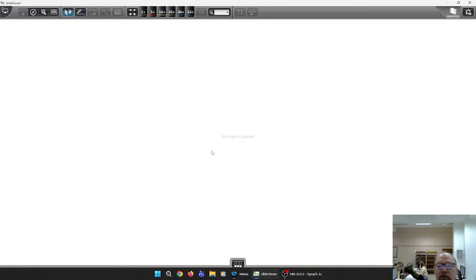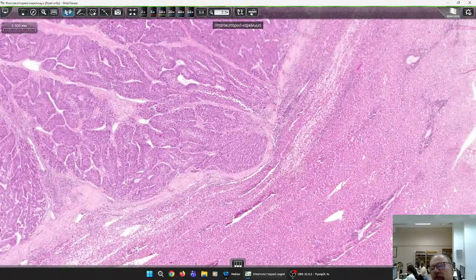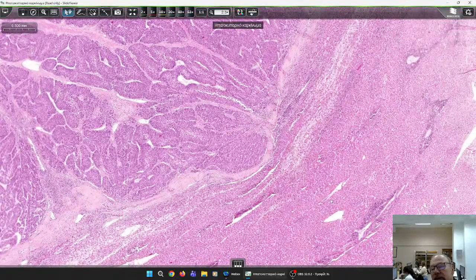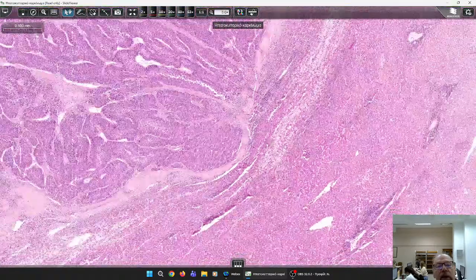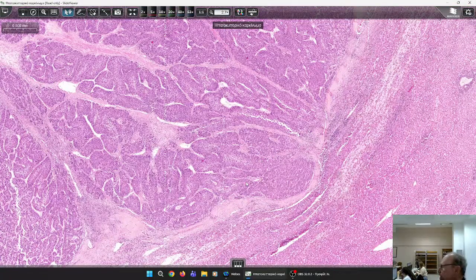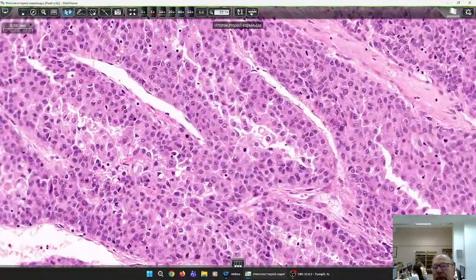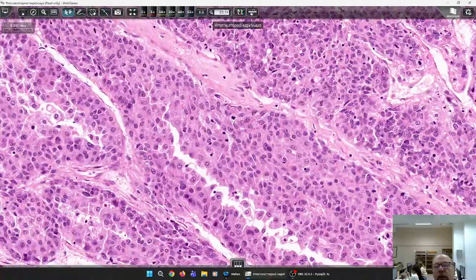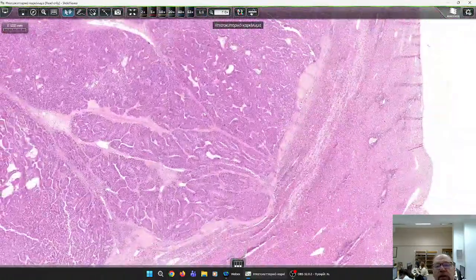And the other case of hepatocellular carcinoma is this one. Pay attention to the adjacent non-carcinomatous parenchyma of the liver. You see here the sinusoids. And here is the cancerous part. Here you can more clearly tell that this is cancer because there is some degree of atypia and mitotic activity, quite prominent.